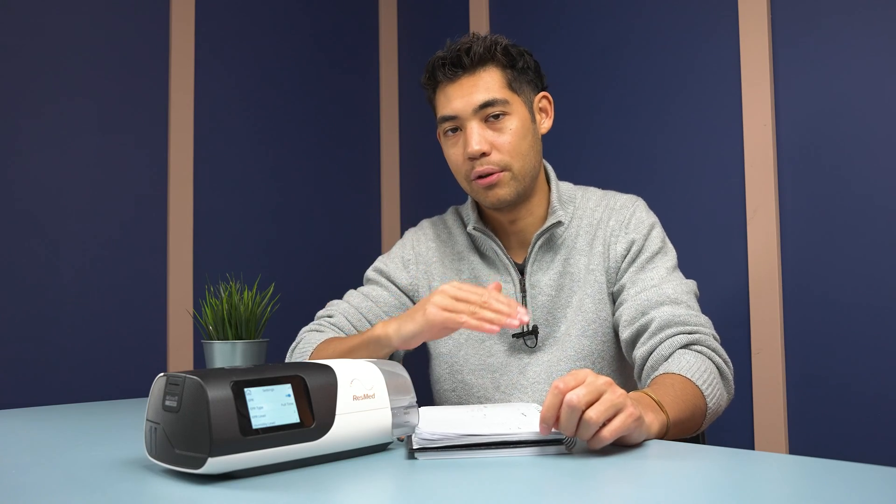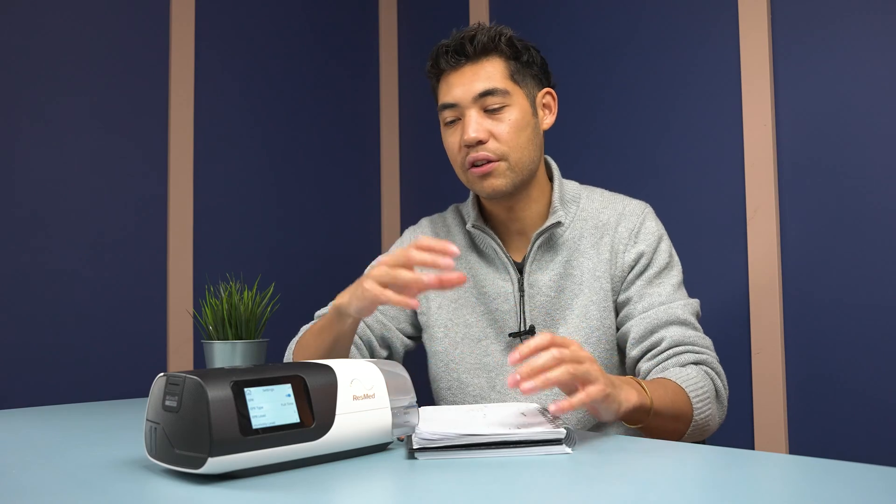ResMed machines are pretty aggressive — you are going to be dipping to that reduced pressure for the entirety of that exhalation time. That means for clients using ResMed products, it might be wise to increase your pressure by one or two to help compensate for EPR.